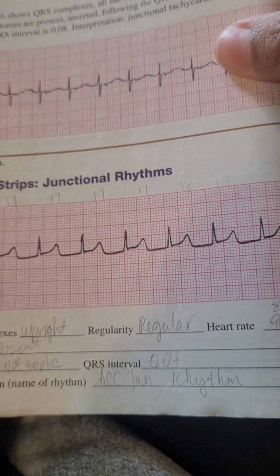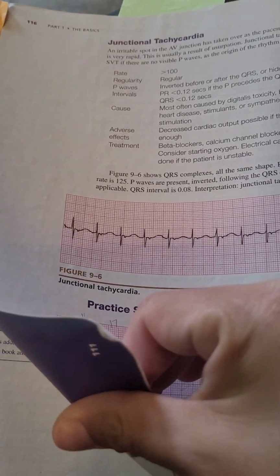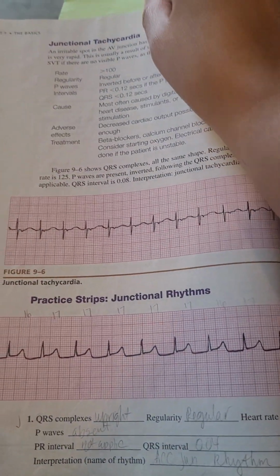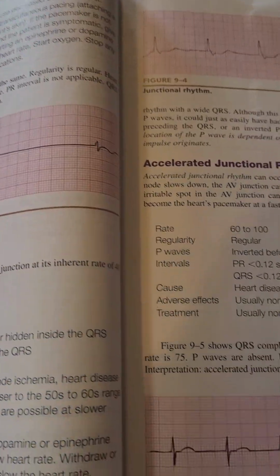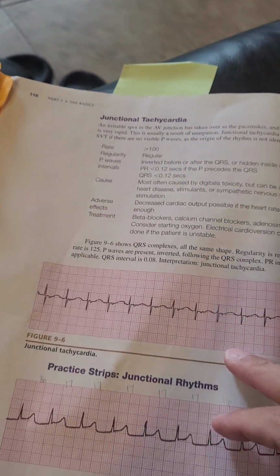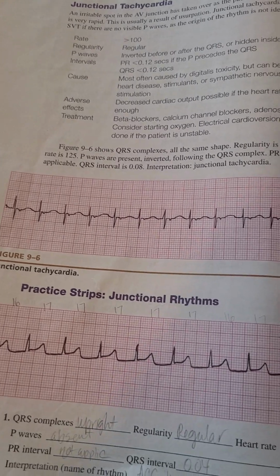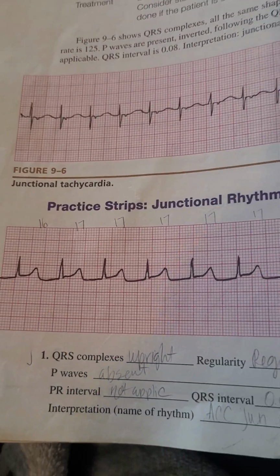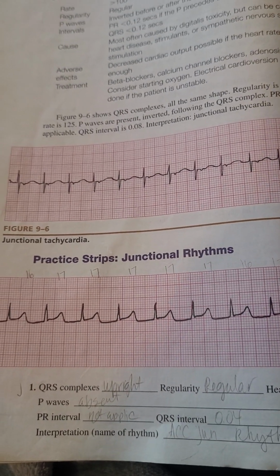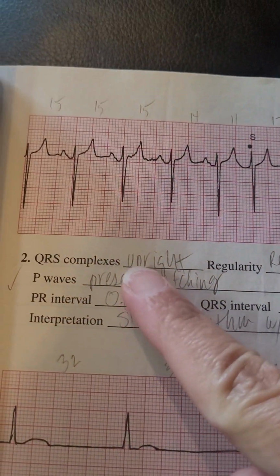So for the most part, you could probably put junctional rhythm, but it probably was accelerated. What did I put? Yeah, I did. Accelerated junctional rhythm. Okay, sorry, that was my bad. So accelerated junctional rhythm, that's what that is. And QRSs are upright, the regular heart rate, like I said, no P waves. So you know that's junctional. Let's see what we have over here.